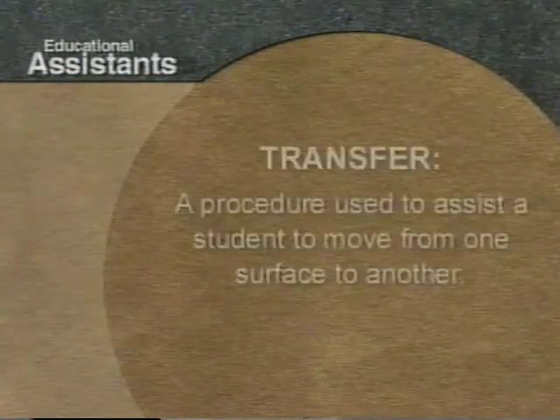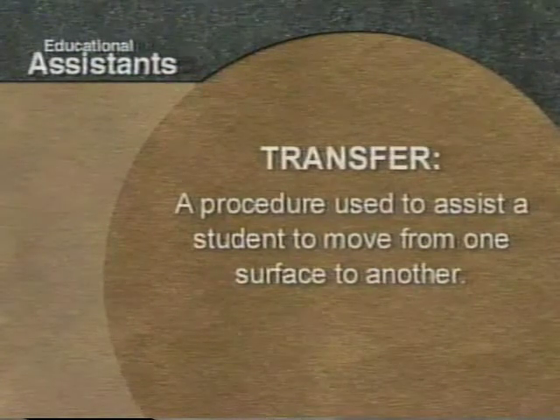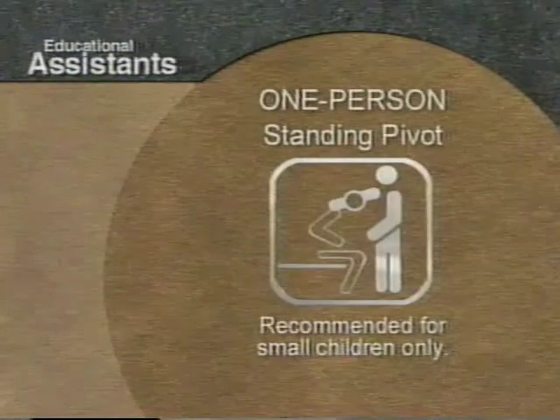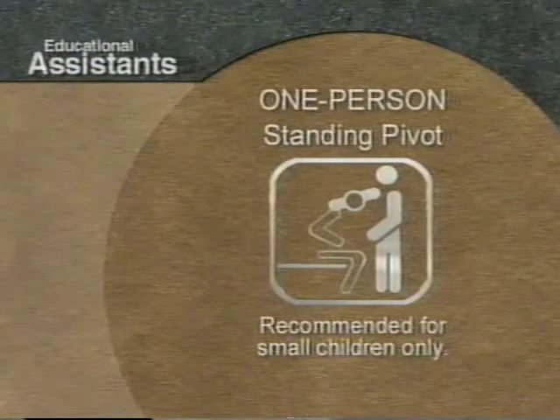This section will equip you with guidance on effectively performing transfers and lifts. Note that for all transfers, the educational assistant must encourage the student to assist as much as possible. Let's look at a one-person standing pivot, as shown in this example of a transfer from a wheelchair to a commode.